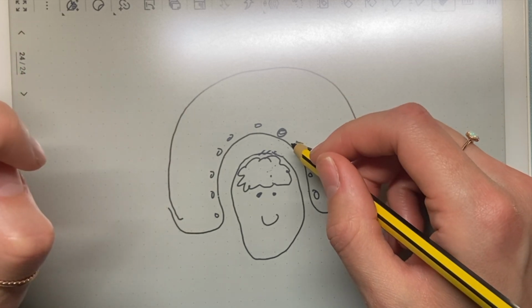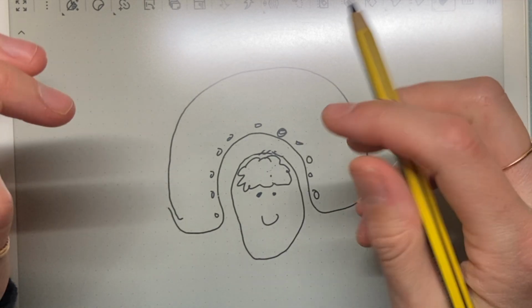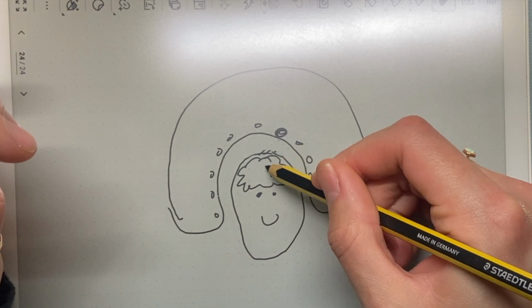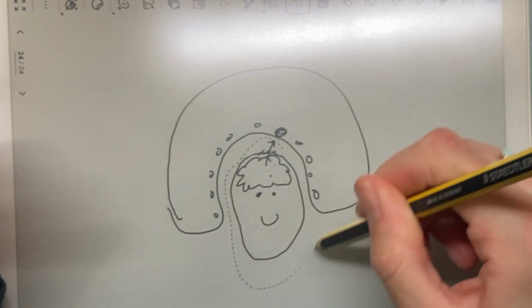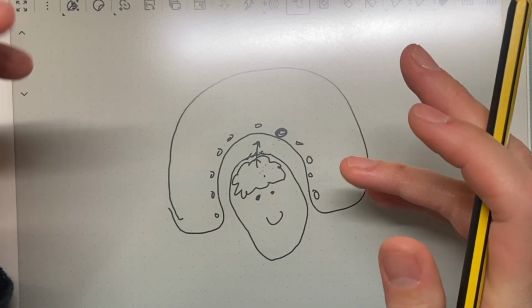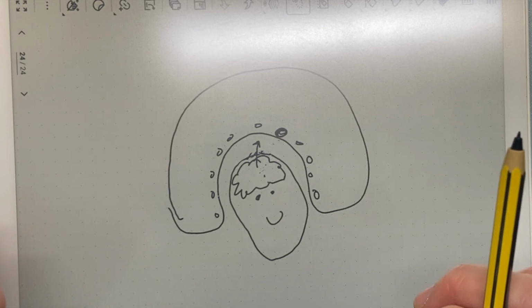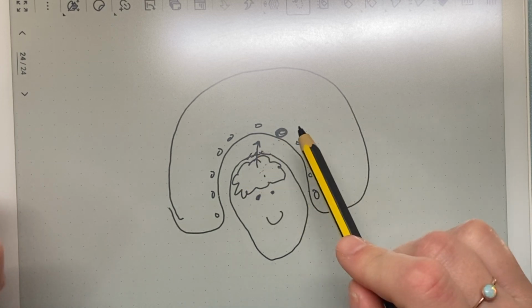You can kind of imagine why it's important, because if a person's head is tilted, let's say this sensor here is picking up activity from this brain region here, and if I tilt this head slightly, then you can see how the estimation of the brain activity may change. But this isn't to say that the head needs to be straight on. It just needs to be in an accurate location in order to get an accurate estimation of the brain activity.